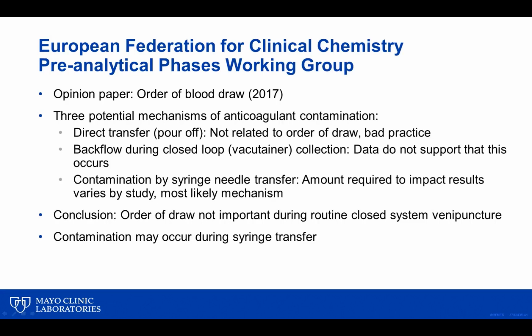And so this is one of the rare situations where we have a CLSI guideline, but we also have this European Federation for Clinical Chemistry Working Group, which did an extensive review and had a consensus conference on a number of pre-analytical questions about blood collection. So the European Federation went over 3 potential mechanisms for anticoagulant contamination, for potassium EDTA contamination of serum tubes when the order of draw is not followed. So whether it's direct transfer or pour off. And again, obviously, if you need serum and you collect potassium EDTA and you pour into that serum tube, then you're going to have a contaminated specimen. This is obviously a very bad practice, and we don't expect to see that where we have trained phlebotomists.